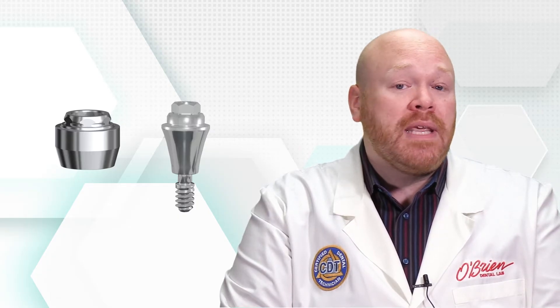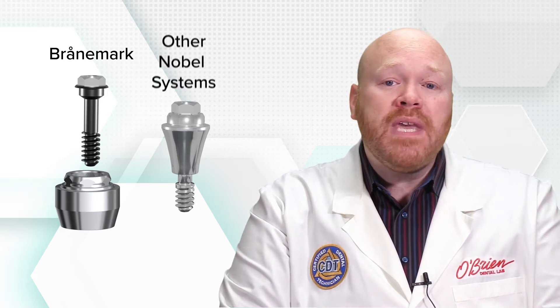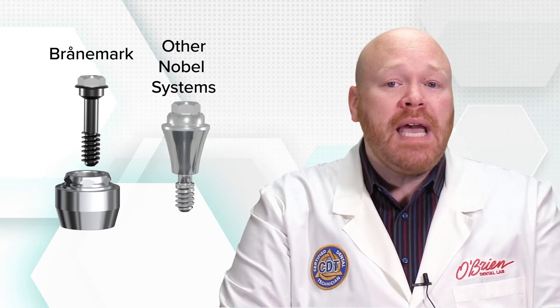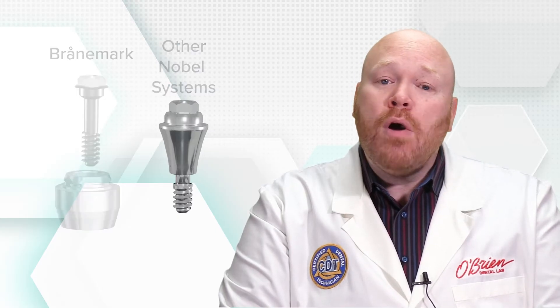Even though the prosthetic connection is the same for both the straight and angled abutments, their designs have some significant differences. The straight multi-unit abutments have a non-engaging connection to the implant. For the Branemark system they have a separate screw, but for the other Nobel systems they actually have a screw that is integrated into the abutment. At the most coronal end of the prosthetic connection, they feature a hex which is used to torque the abutment into place.